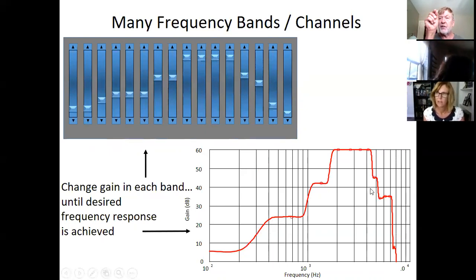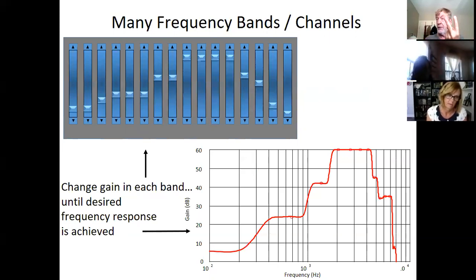Now you can exquisitely sculpt the shape of a frequency response to match any hearing loss in the world. That's where we are today with today's digital hearing aids. Multi-channel, programmable. So it began with a consideration of Bill and Till that kind of led to, hey, let's not make a hearing aid only Bill or only Till. Let's make a hearing aid 2-channel, with the low channel being Bill and the high channel being Till.